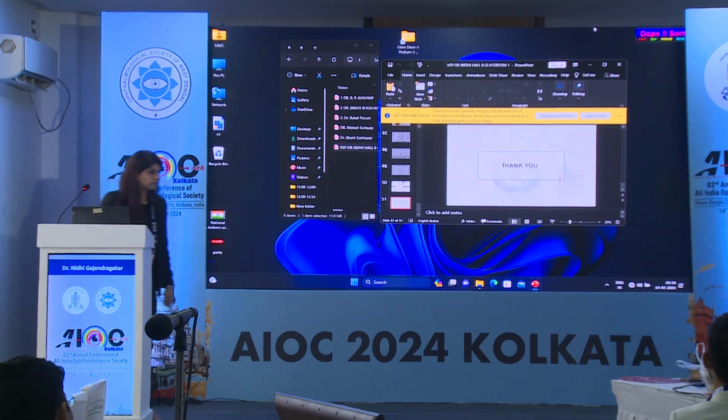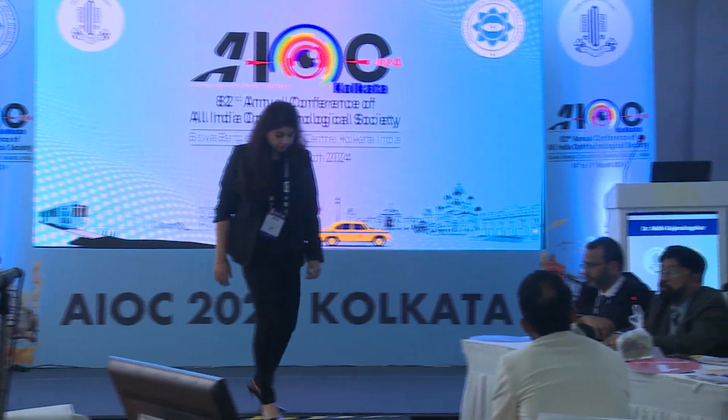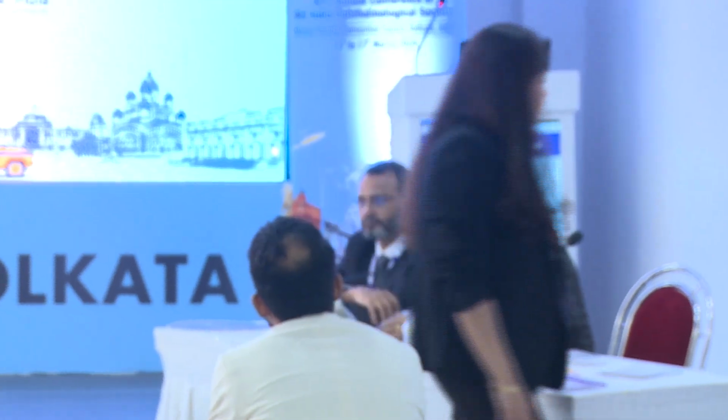So now in this instruction course, there were 3 parts. Number 1, whom do you refer to for electrophysiology? What are the patients, what are the kinds, what are the diseases that you suspect? Number 2, a technician. The technician has to be an expert. Whatever investigation you have ordered, he has to prepare the patient and put the electrodes accordingly. Number 3, you have to read the result that comes out from the machine or a printout. And number 4 is what waves you have to see. Somewhere you have to see the A wave, somewhere the oscillations, somewhere the B wave, and somewhere the N95, P50 and P2 waves. So if there's any question from our audience, they can ask us.